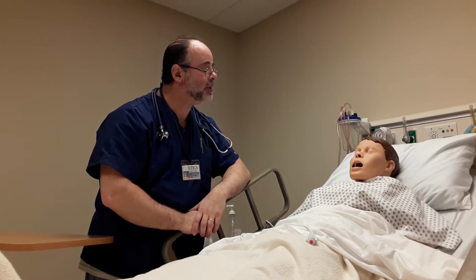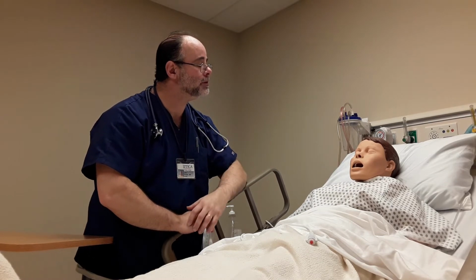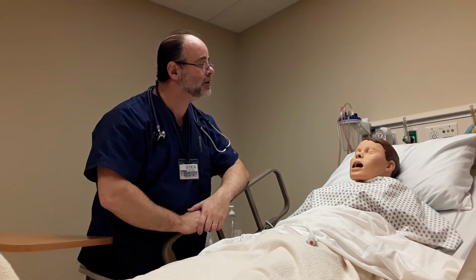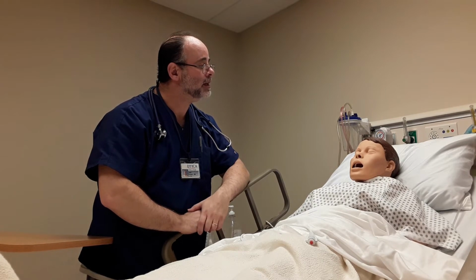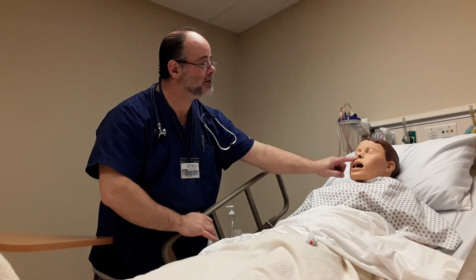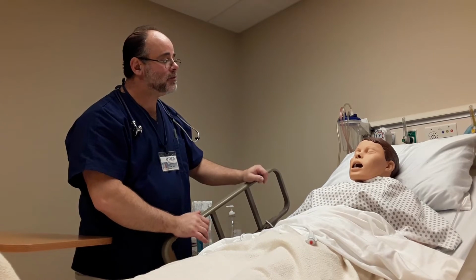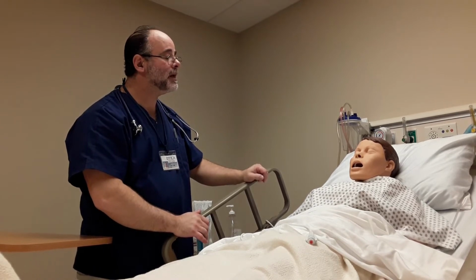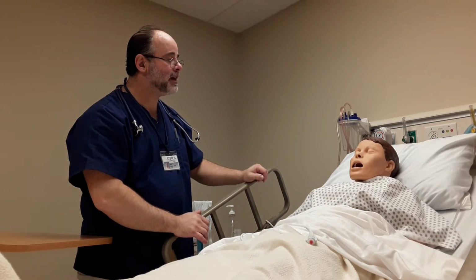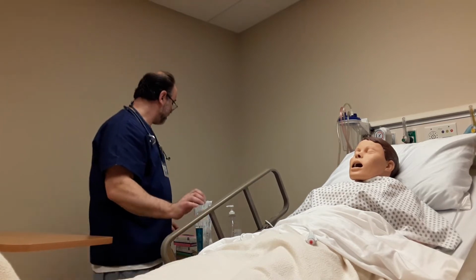Next thing I will do, I will ask patient history if they have ever had a problem with anything in their nare, as far as any kind of a break in, broken nose or a deviated septum or anything like that has occurred, and patient has indicated no. I also checked, as you saw, for nasal patency by patient breathing out one side and then the other to see if there's any deviation with that, and there does not appear to be. At this point, I'll ask patient which side he would like for the NG tube to be placed, and he indicates to his right side, which would be on this side. So I'll prepare everything now.